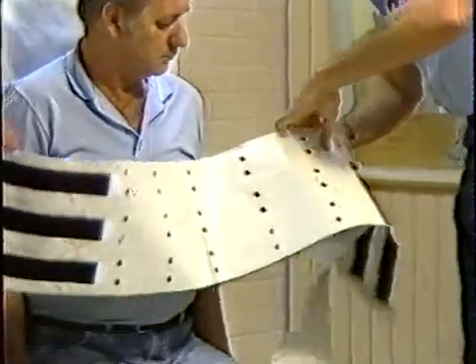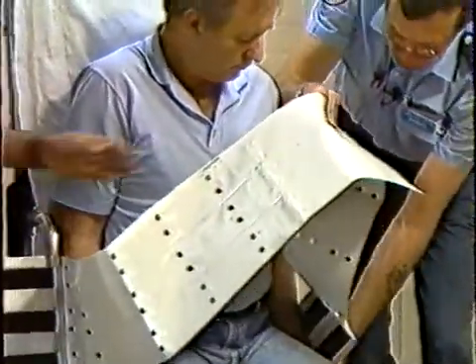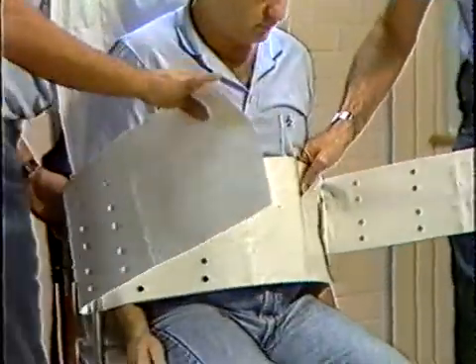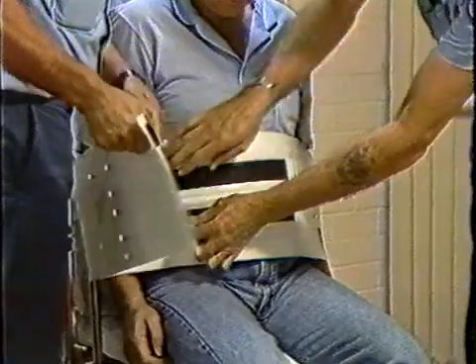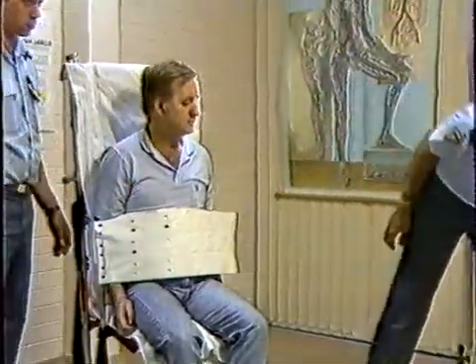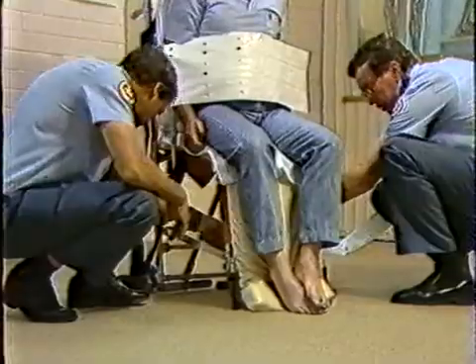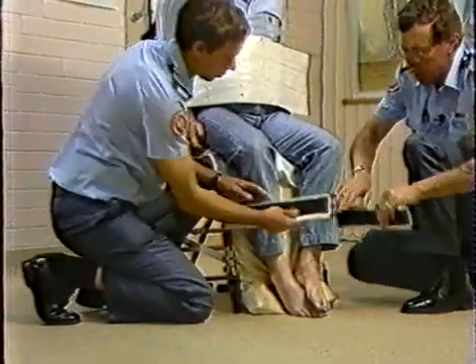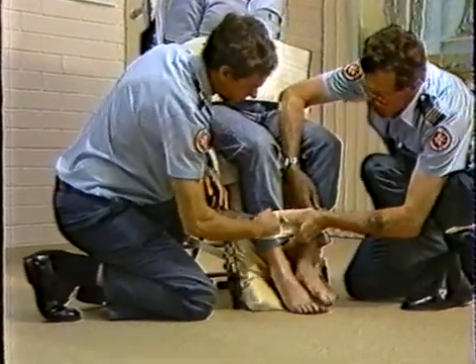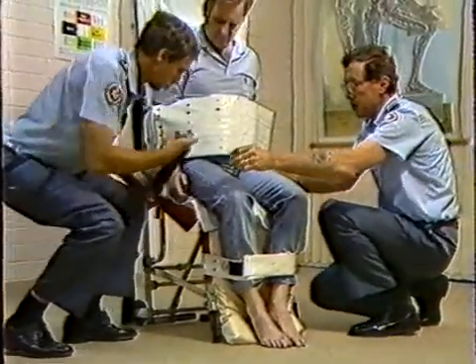Making sure, if you go under the rail there and I'll go under this side, that the arms are inside the bandage, because as we know the patients unfortunately have a habit of trying to help and grabbing. And there we go. We now have the top section done, and the only one left now is the legs. Smooth edge through and meet anywhere on the legs there, and that's on.